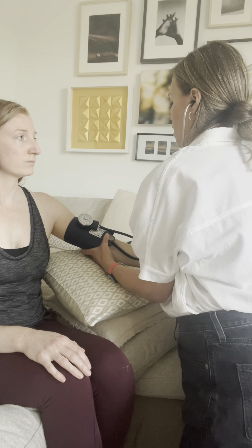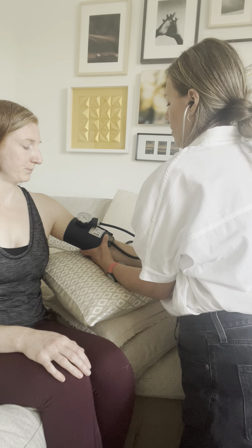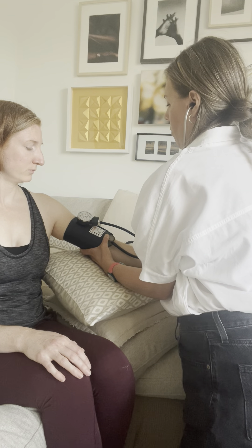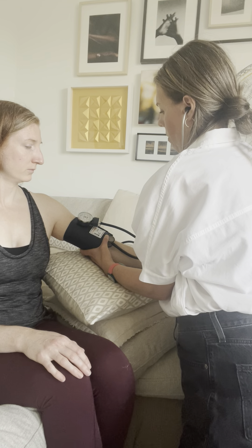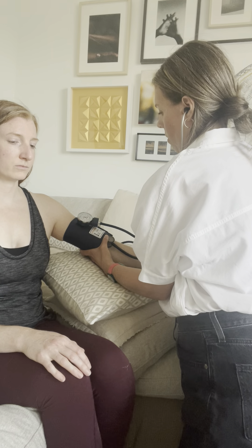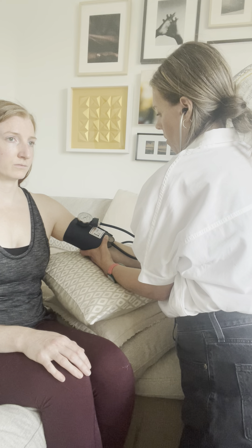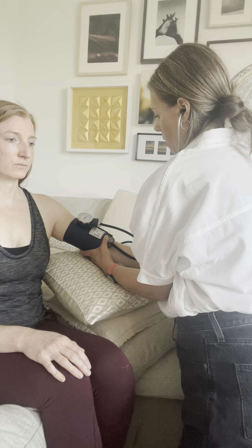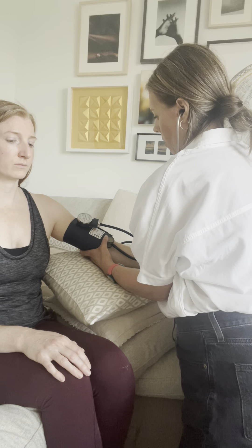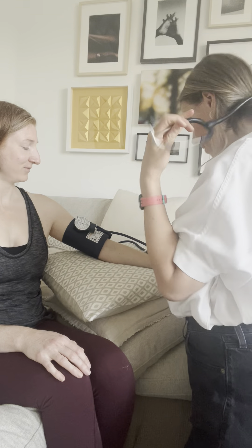All right, are you comfortable like that? There's going to be a little squeeze, but don't worry — I'll release the cuff. Nice. Pressure's nice and healthy.